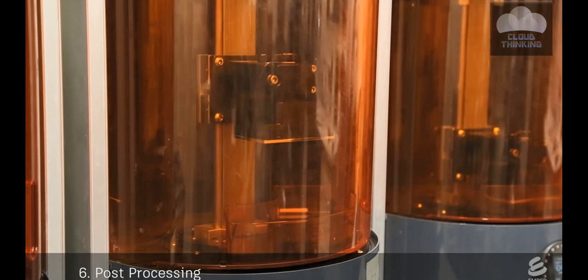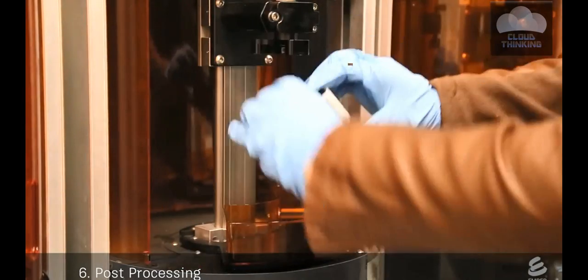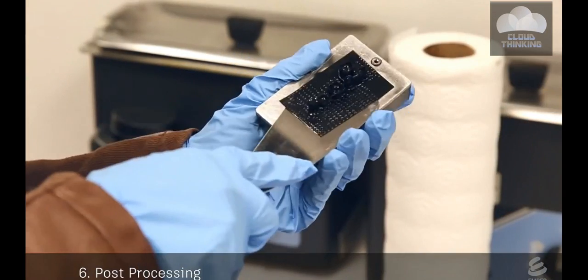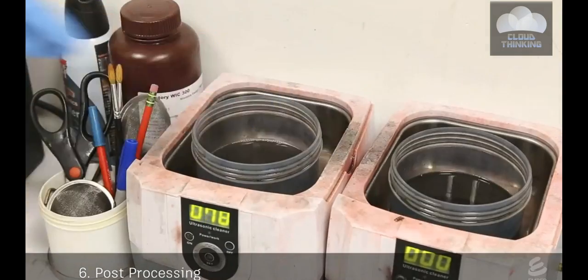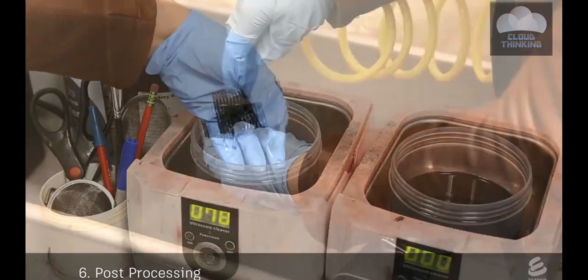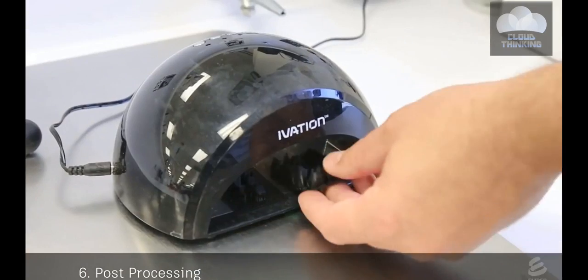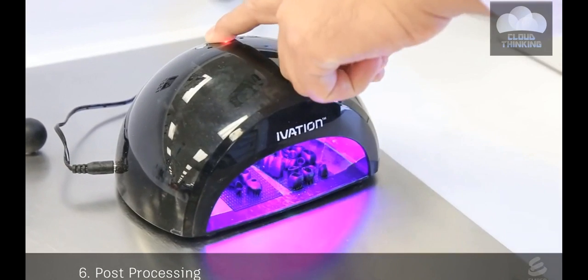After the print is done, a tech removes the build head from the printer, scrapes off the print, washes it in alcohol, and dries it with an air gun. Then the print goes through a post-curing step under a UV lamp.